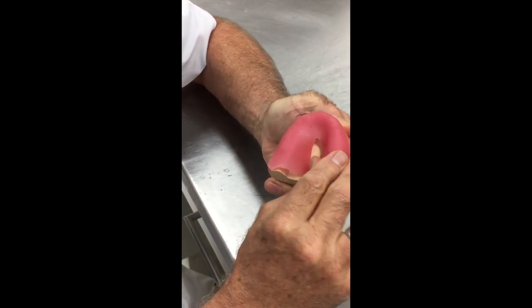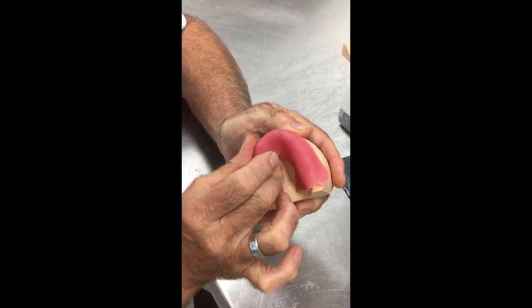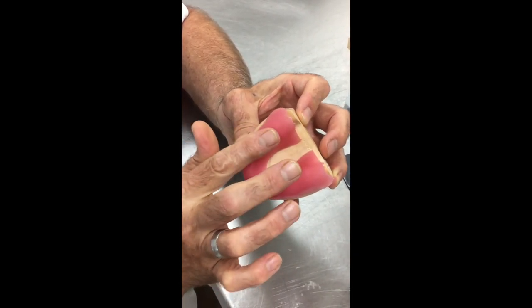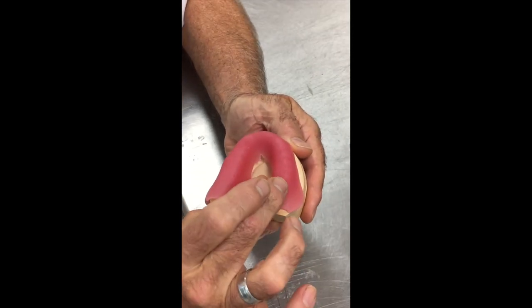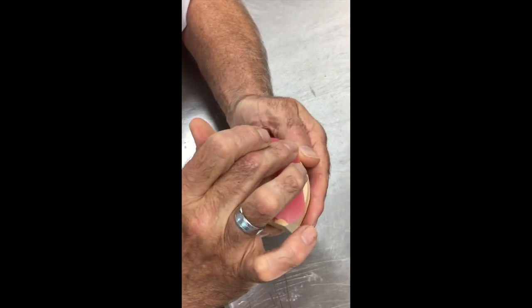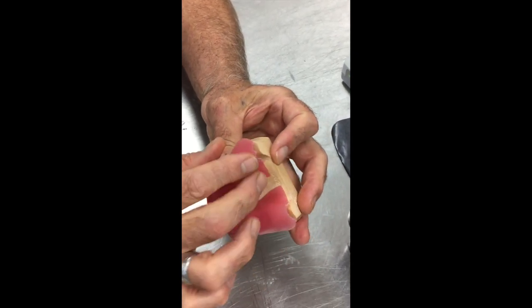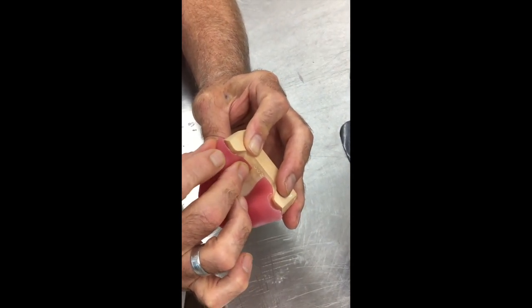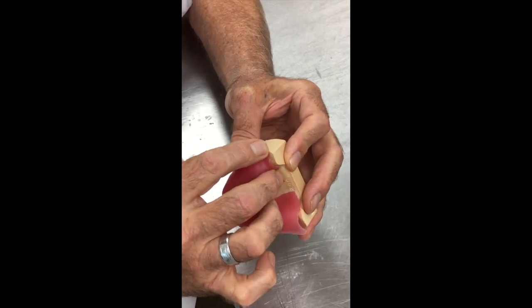I like to use this nice big smooth part of my hand to do this, and gradually this tray material, particularly if you've had it in the fridge and it starts to warm, will settle down nicely, and we'll end up with a nice consistent thickness over the whole of the tray without pushing a thin spot. Now, where we know our tissue stops are, we're just going to press and make sure that we make contact with the material below there, because that will make sure that our tissue stops are bonded to the tray body. Now, remember the trick with adapting the wax around the back of these teeth, we're going to do the same here.